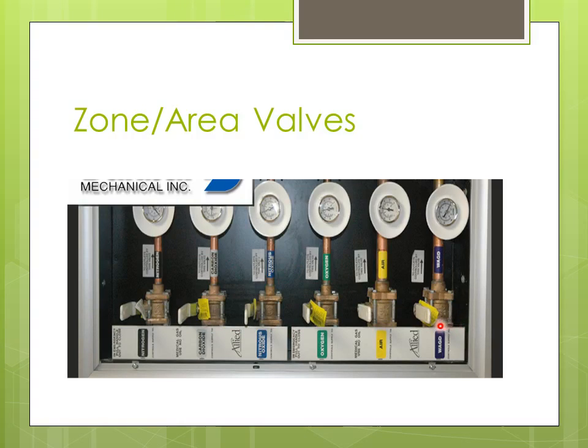This is one of those things where we've talked about over the years about exercising these. Do we exercise these like we should? What happens is if you don't exercise these, some of these valves, depending on what kind of valve they are, gate valve, or depending upon if it's a needle valve or otherwise, they can get dry rot inside. And then when they go to use them, you can get all kinds of problems.